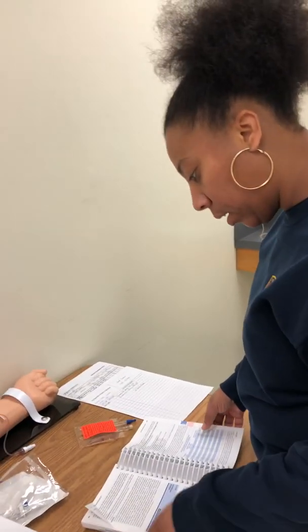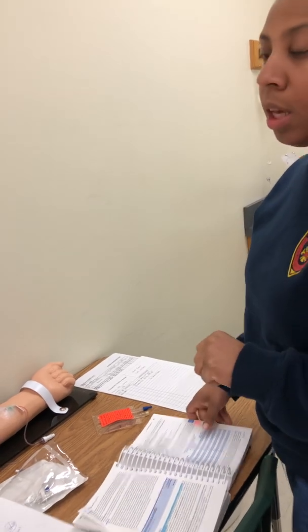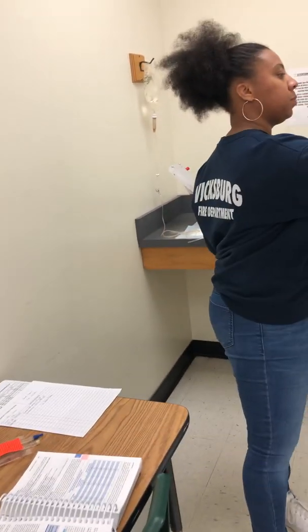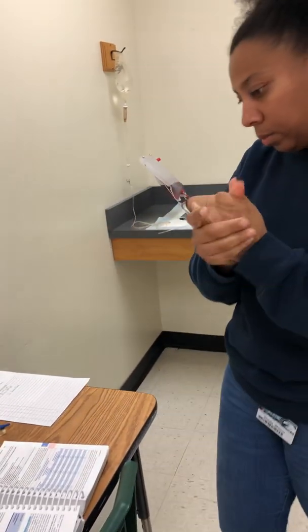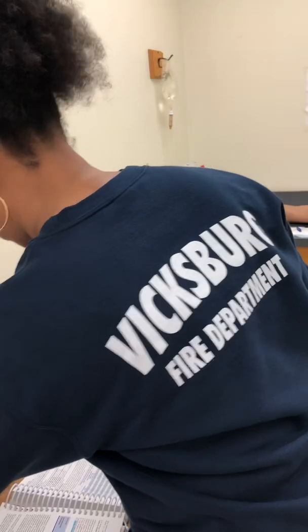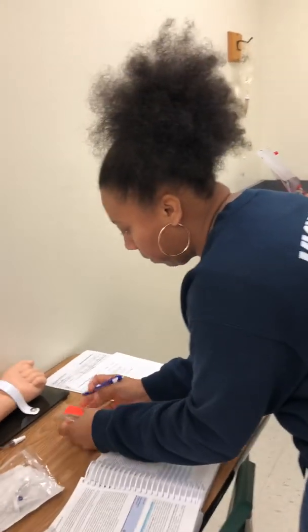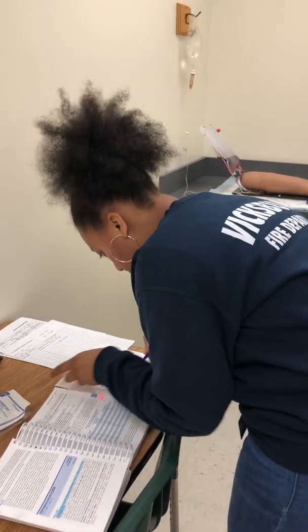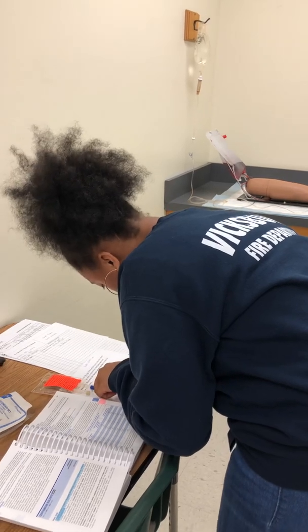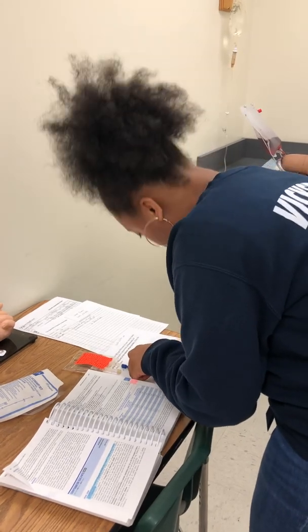Okay, so once I get all of that situated, I will go and calculate how much I'm going to give my patient. At this time, go ahead and do hand hygiene. Okay, so she's receiving 80 milligrams. And this is in 50 milliliters, and she has a 10 drop set. Okay, so she will be getting 8 drops per minute.